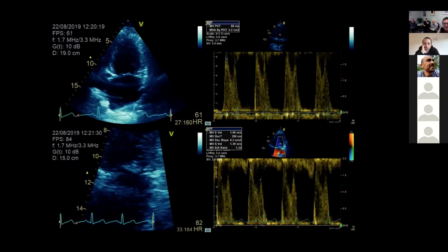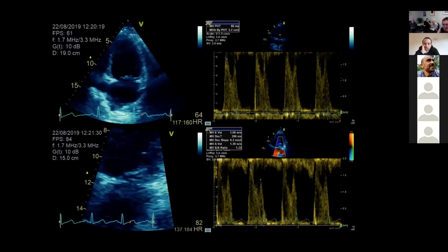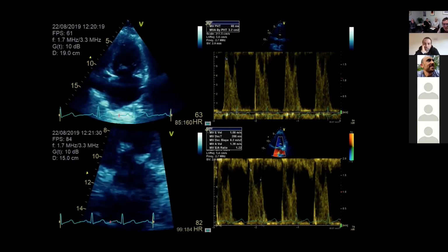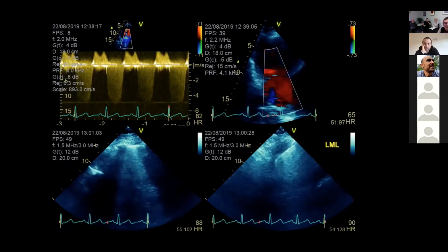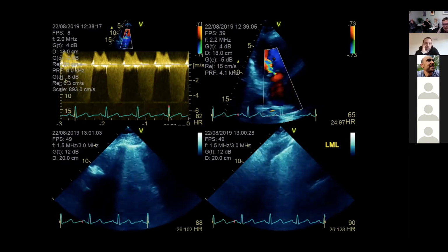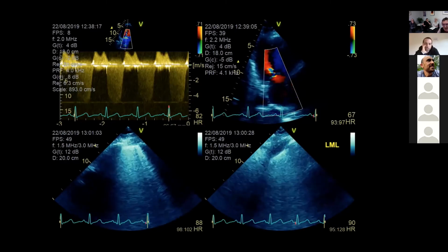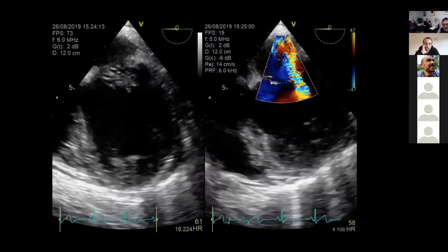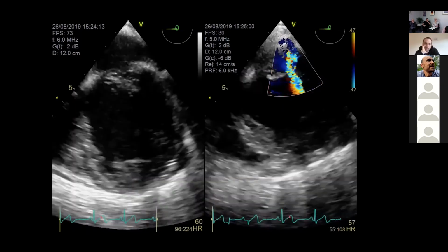And obviously, if we're trying to determine what the problem with the mitral valve is, this is just to give you some idea of the mitral regurgitant flow across the valve, a different view of the mitral regurg, the fact she's got a lot of B lines in the lungs. Anyway, so to take it further, we actually did a TOE. Would you like to comment on this? Anyone?